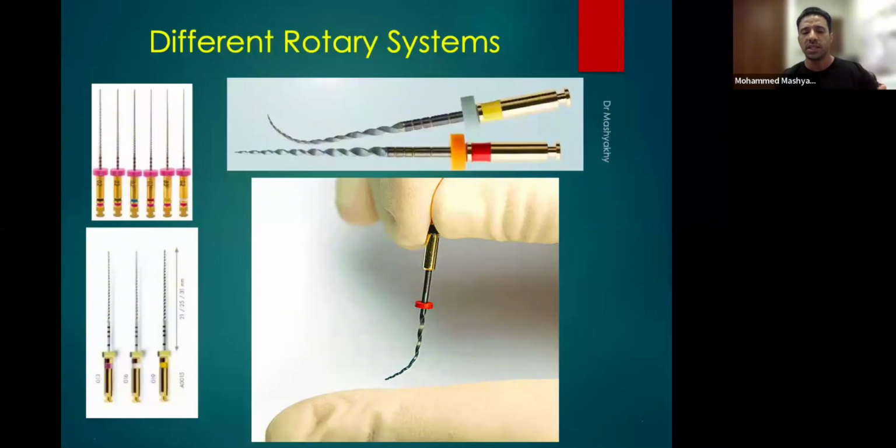The original endodontic files, which are the NiTi files, are very flexible, but they're prone to fractures. They don't last long working with the teeth. But with heat treatment, they put the files under some heat until they get some extra properties. It becomes more flexible, more resistant to fatigue, and when you bend it, it stays as it is. This will help you if there is another canal, so you can negotiate that canal. You can take the curve and put the file in the canals.